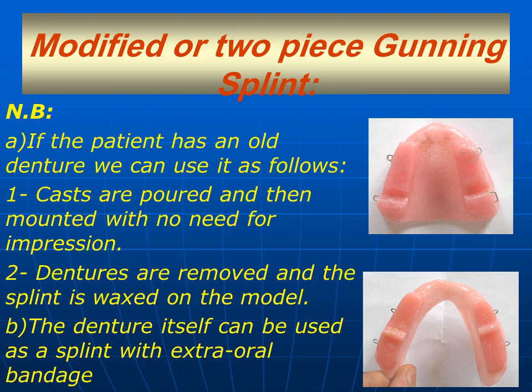That's to say, dentures are removed and the splint is waxed on the model.